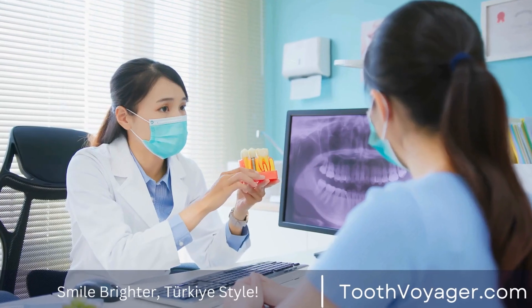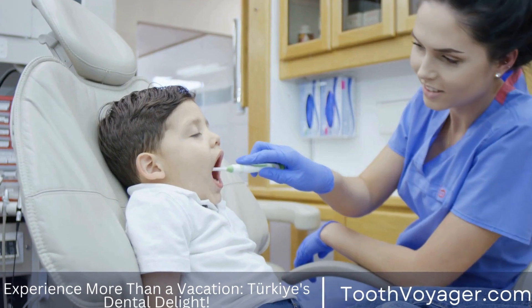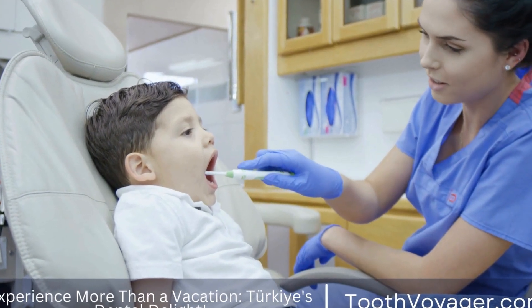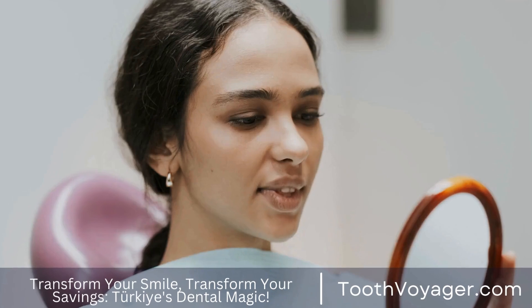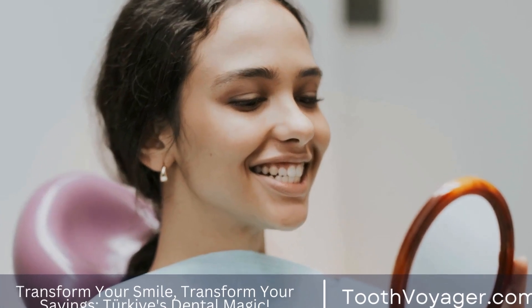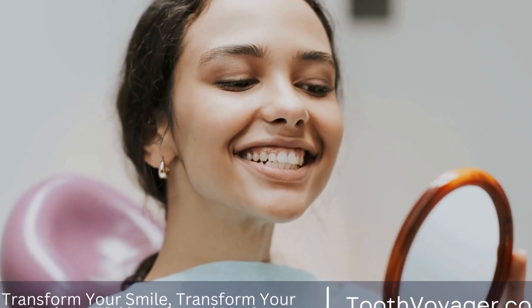Step 5: Restoration. Finally, the replacement teeth, or crowns, are attached to the abutments. The crowns are custom made to match the shape, size, and color of the patient's natural teeth, resulting in a seamless and natural-looking smile.